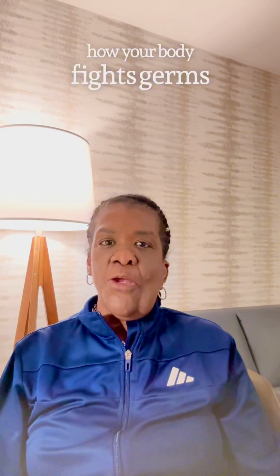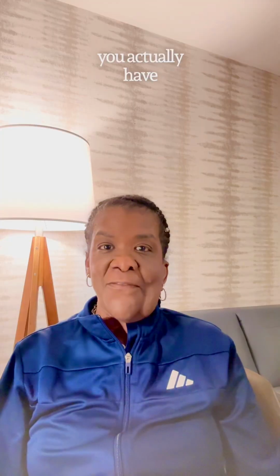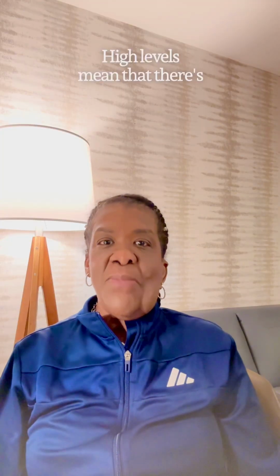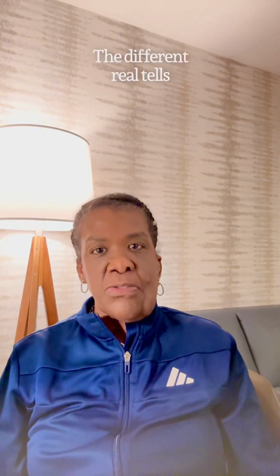White blood cells. Now, this means how your body fights germs. The white blood cell count tells us how many germ fighters you actually have. High levels mean that there is infection or inflammation in the body, while low levels mean that it's harder for you to fight germs. The differential tells us what type of white blood cells are in your blood. Each type has a different job.